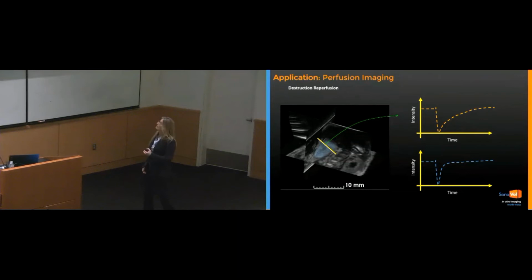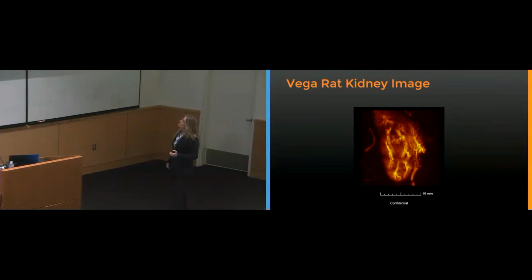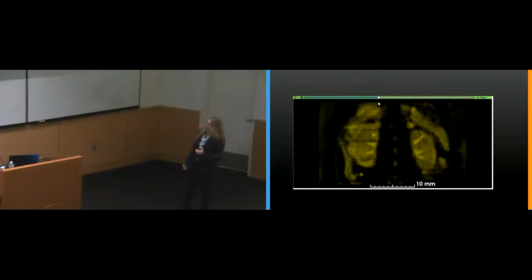And then this is the vascularity of a kidney in the rat. And on this image, I was nicely surprised, you can actually define the spleen really well. So we're starting to work on spleen volumetric measurements, especially for immuno-oncology. Apparently, when you give CAR T-cell treatments, you have a lot of response in the spleen as well. So that's one thought of pursuing that.